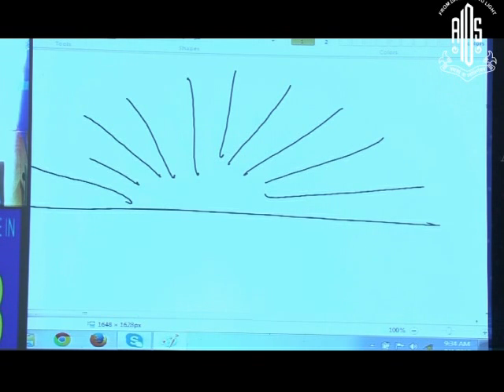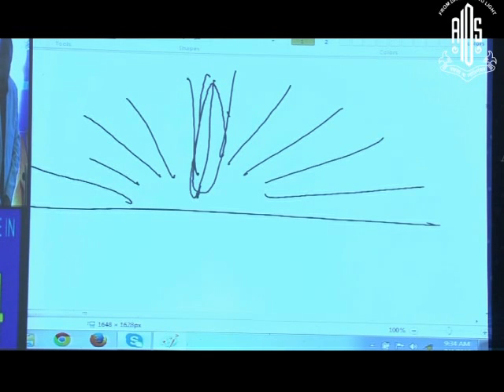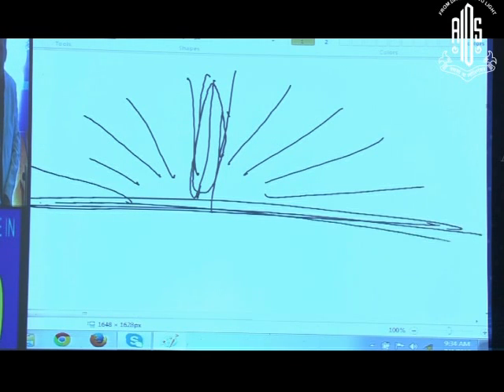Imagine the line in the vertical meridian looks clearer, then probably he will require a negative cylinder at 180 degrees. This is something that you have to do and learn. You have to understand why it happens by reading some theory, but I think we don't have time for that. So we'll go to the next one.